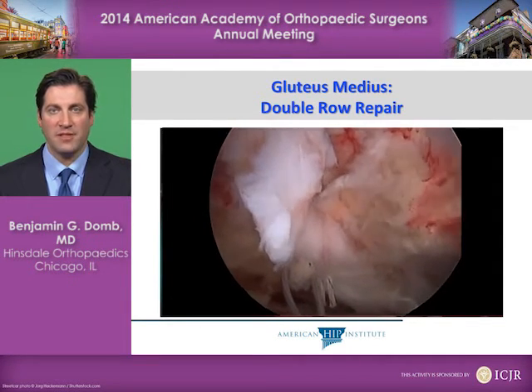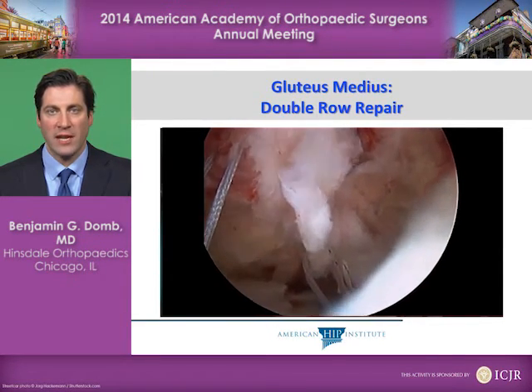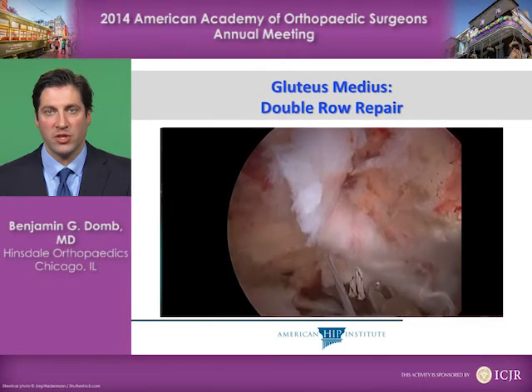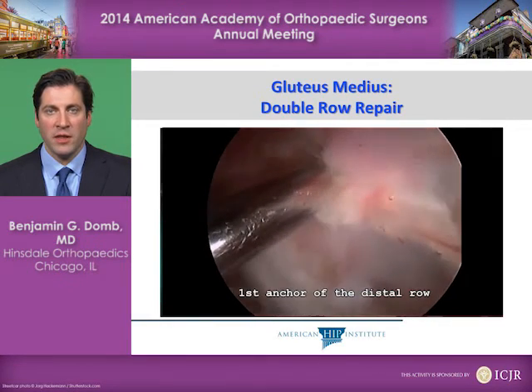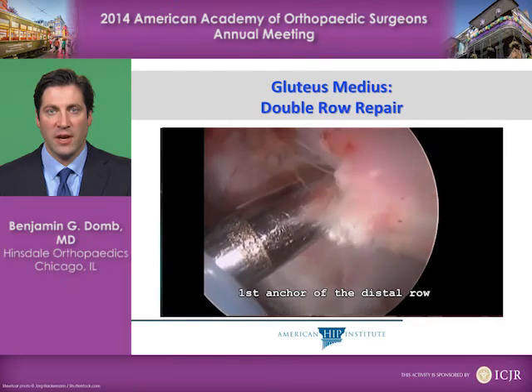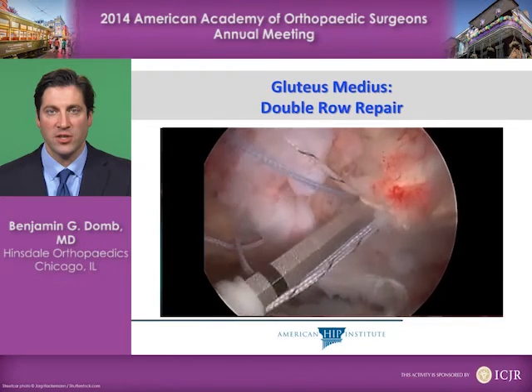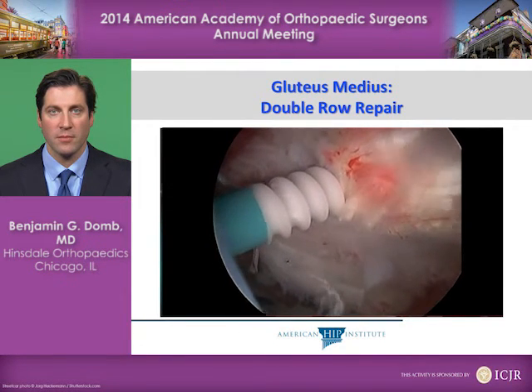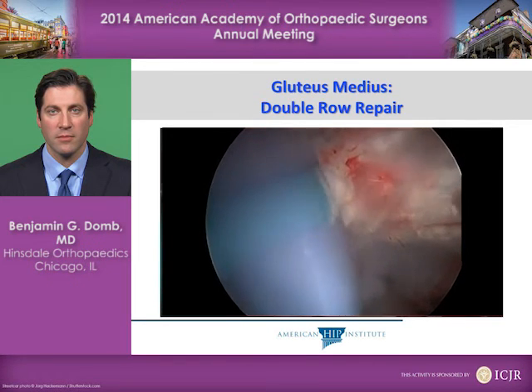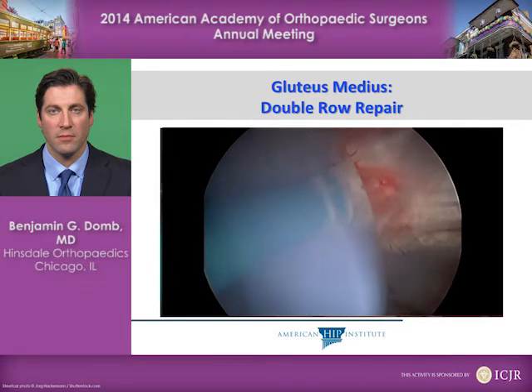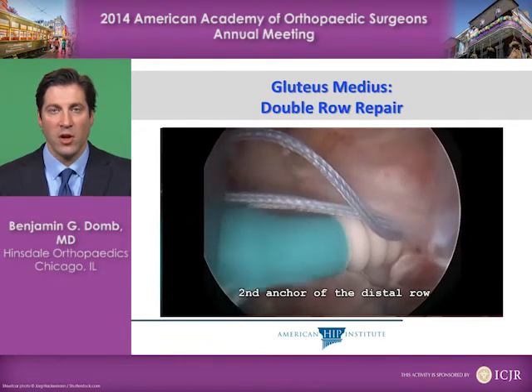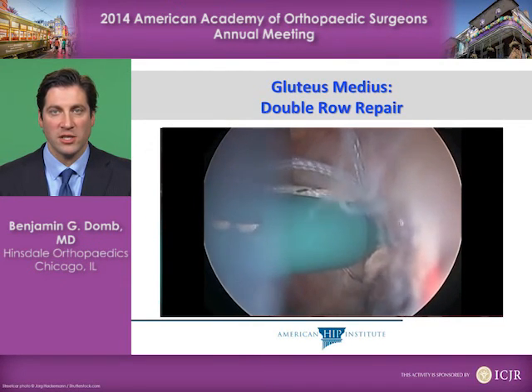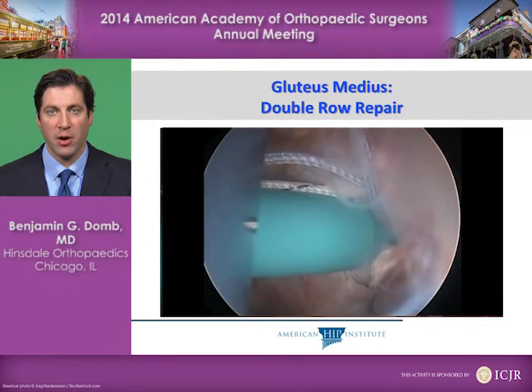We see that we have quite a bit of tendon remaining to complete the double row repair, and we'd like to compress all of this remaining tendon against the lateral facet, where we've created a bleeding bed of bone. We'll accomplish this with a suture bridge construct. We take one limb of suture from each of the knots and anchor it to a distal anchor near the vastus ridge — a total of four sutures brought to the distal anchor, one from each of the proximal row knots. We'll then place a second anchor in the distal row containing the other four limbs of suture, achieving a crisscross suture bridge construct which compresses the tendon against the bleeding bed of bone on the lateral facet.